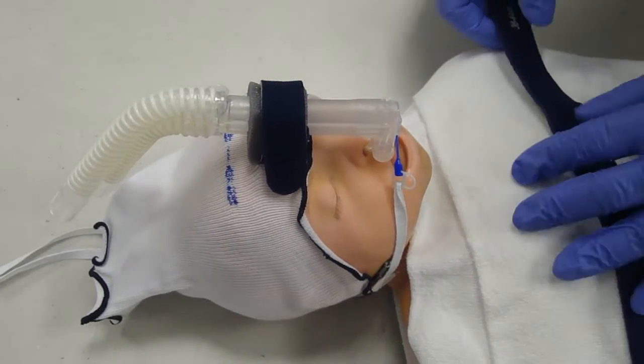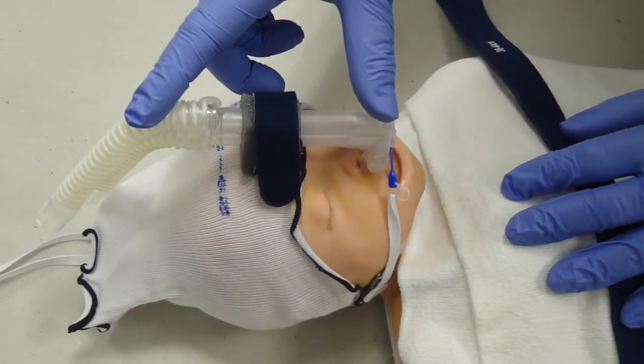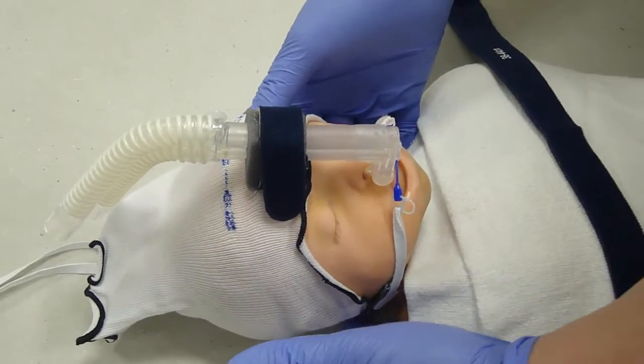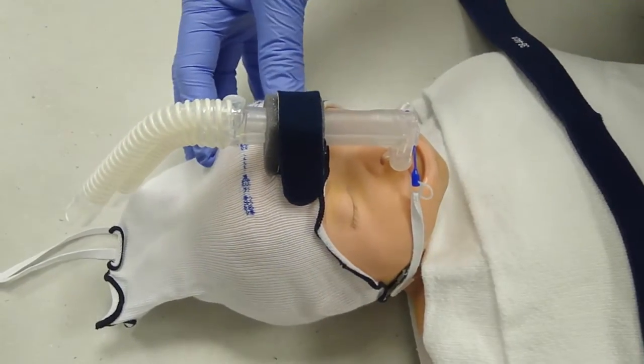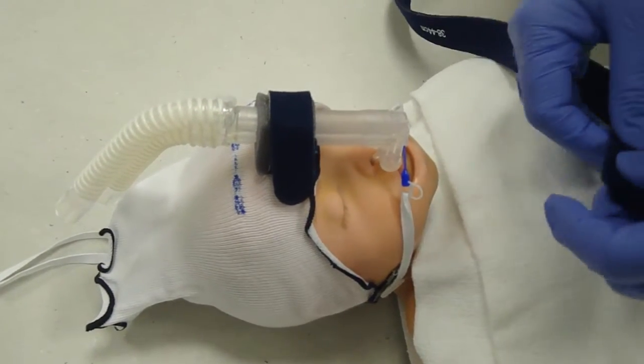If your infant is not bubbling on the CPAP and you notice that their mouth is open, you have a nice positioning of your trunk, your tabs are way low down in the back of the head, your hat is above the eyebrows, and you have good placement — you may need to utilize a chin strap.